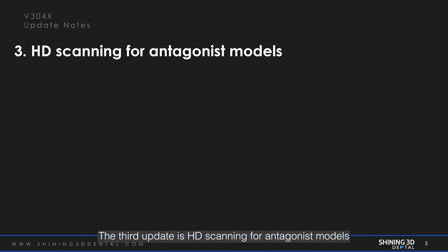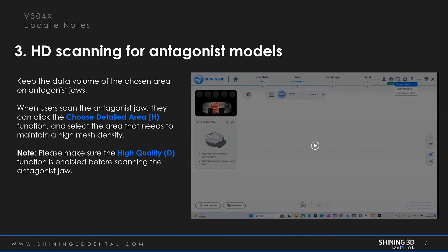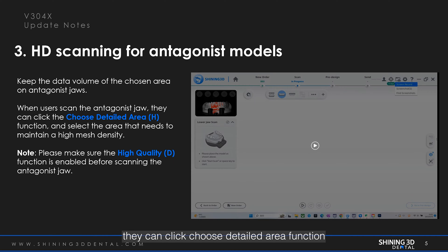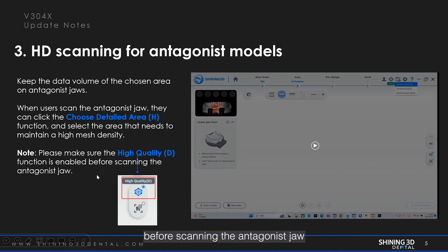The third update is HD scanning for antagonist models. We can keep the data volume of the chosen area on antagonist arches. When users scan the antagonist arch, they can click the choose detailed area function and select the area that needs to maintain a high mesh density. Please make sure the high quality function is enabled before scanning the antagonist arch.